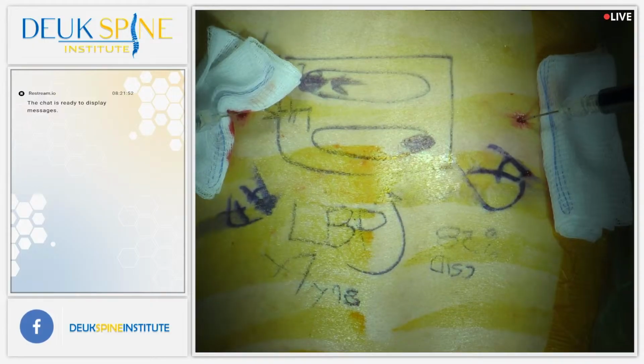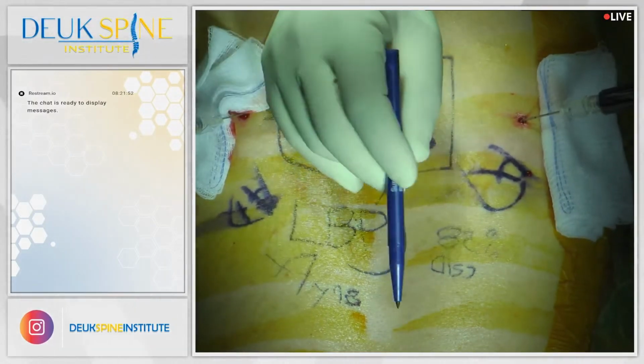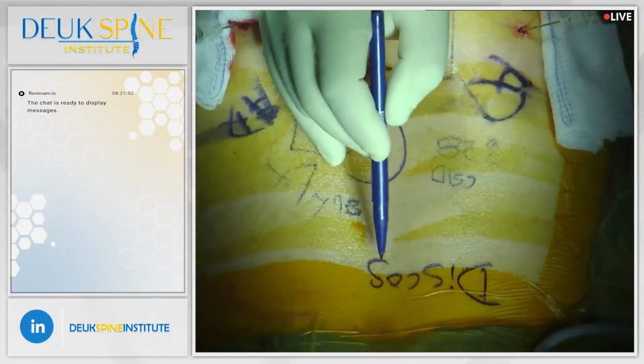Any questions from the audience at this point? No questions. All right, I got to work on my upside down writing, but in the meantime, we're going to be performing what's called a discogram. Our patient discogram.